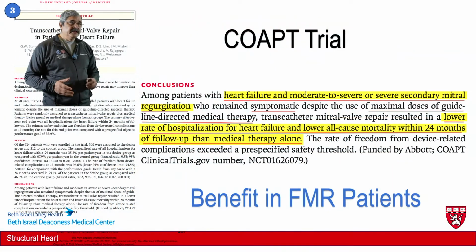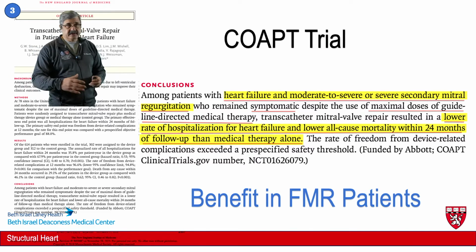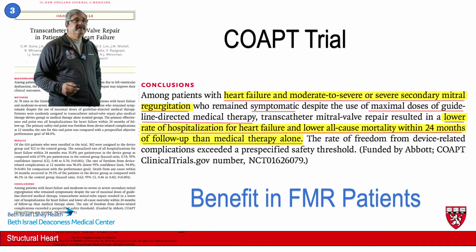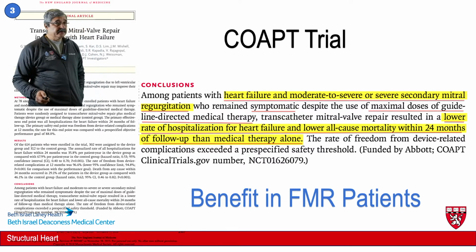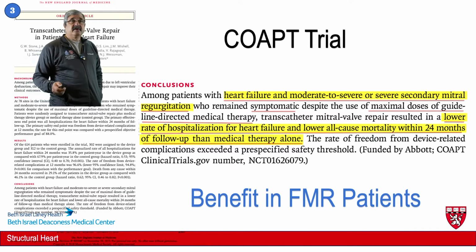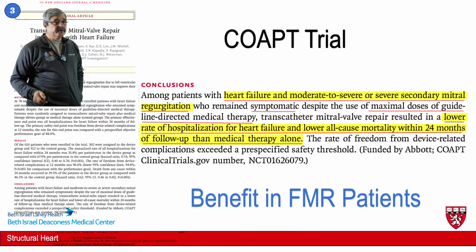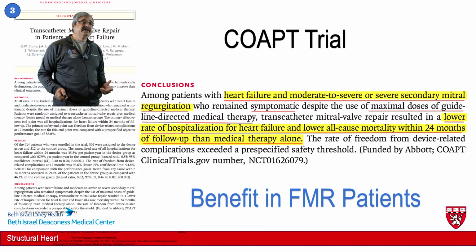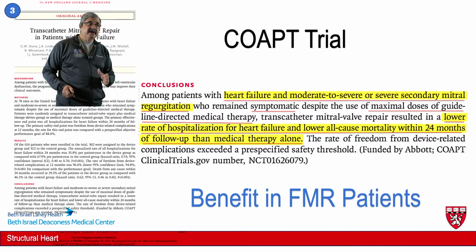Now, the first major trial was the COAPT trial. We'll go over the numbers in these patients and everything. But this demonstrated that in patients with heart failure and moderate to severe secondary mitral regurgitation, not primary, there was a lower rate of hospitalization for heart failure and lower all-cause mortality within 24 months. So, bottom line, the COAPT trial, published in 2018, demonstrated benefit of MitraClip in patients with secondary MR at about 24 months.